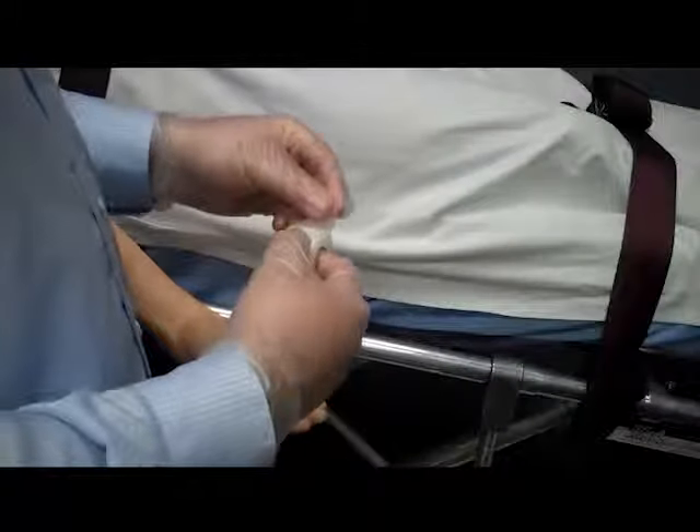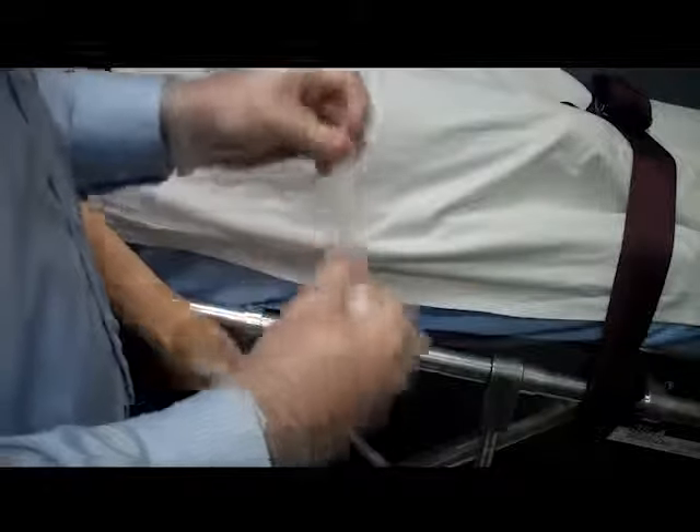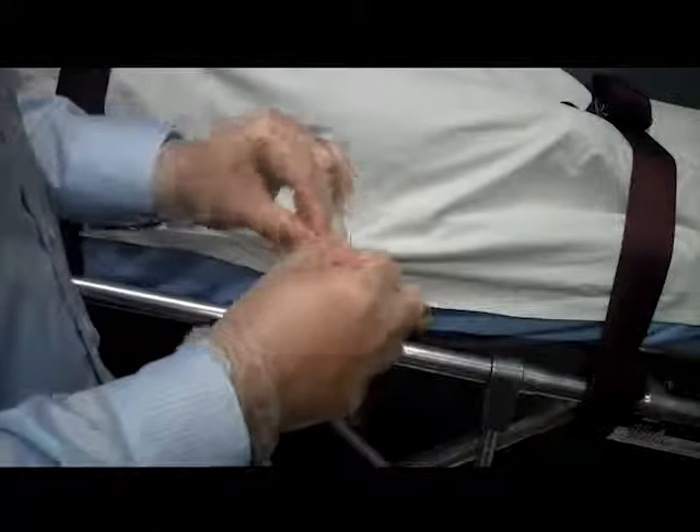To finish getting ready we are going to tear three or four pieces of tape. We do this before the venipuncture so the tape is ready and easy to use. Finally I want to make sure I have everything else I need to start an IV. I want to do this before the procedure since my hands will be full.